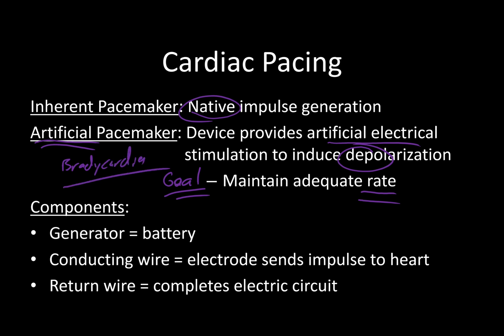Once we know for certain that the patient has a bradycardia or a conduction disorder that warrants permanent pacemaking, the cardiologist will then determine what the most appropriate pacing device and mode is for that patient. And it really is just up to the MD, and it has to be tailored with every case.